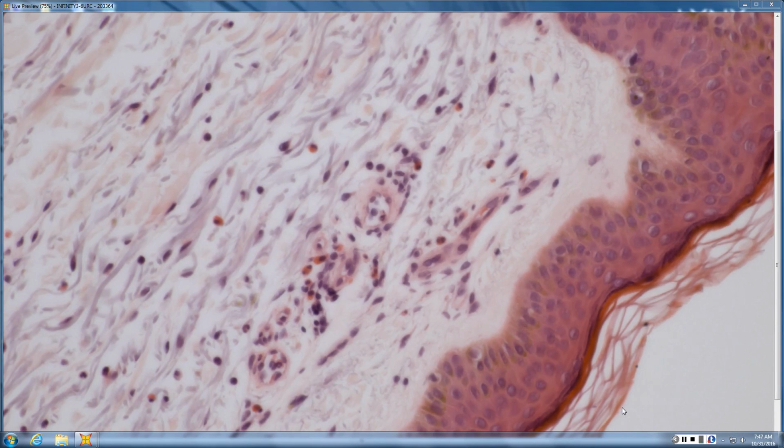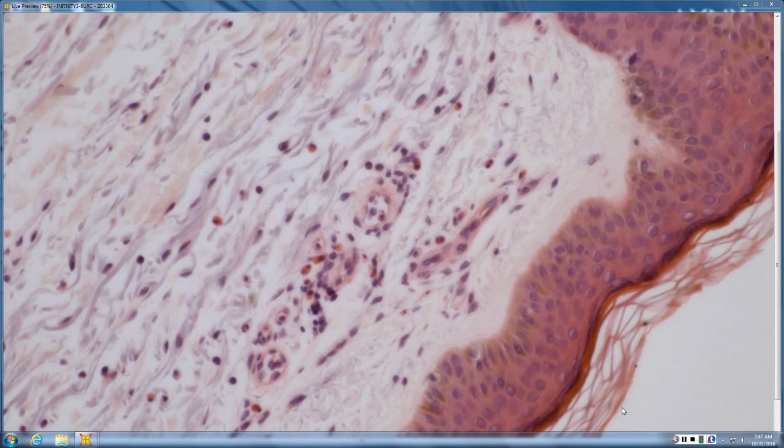Okay. So papillodermal edema with lymphs, think polymorphous light eruption or perniosis. Papillodermal edema with neutrophils, think Sweet's. So papillodermal edema with lymphs, what do you think? PMLE or pernio. And papillodermal edema with neutrophils, think Sweet's. So it looks just like Sweet's, but it's not Sweet's. What else can look just like Sweet's?